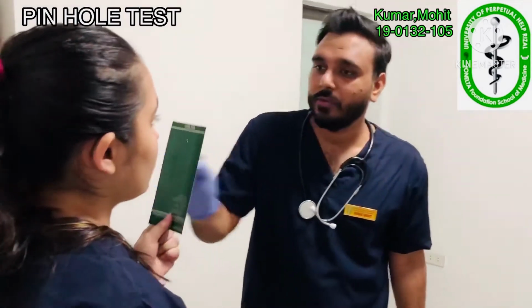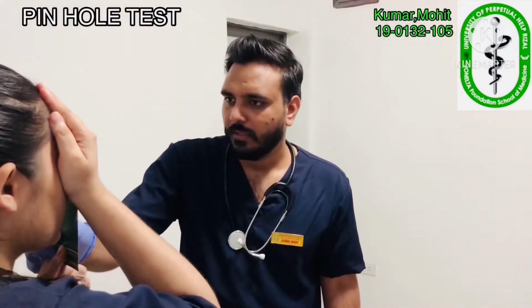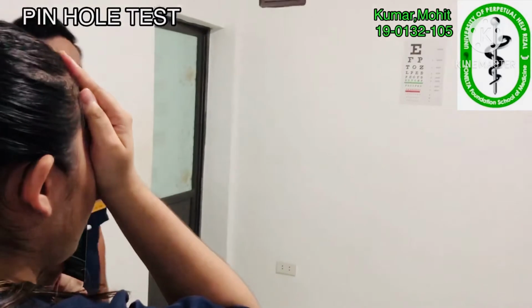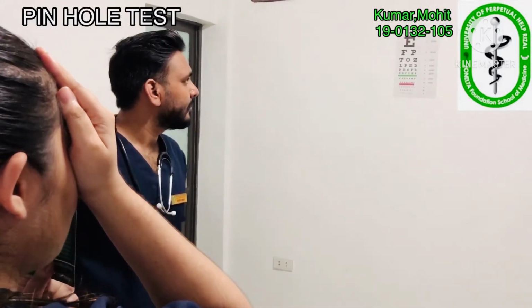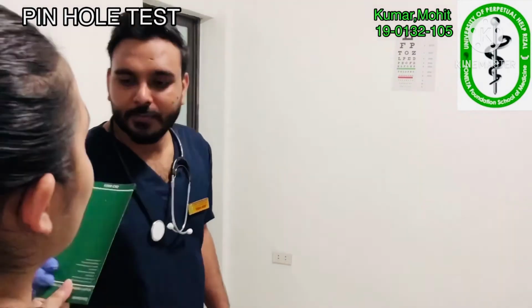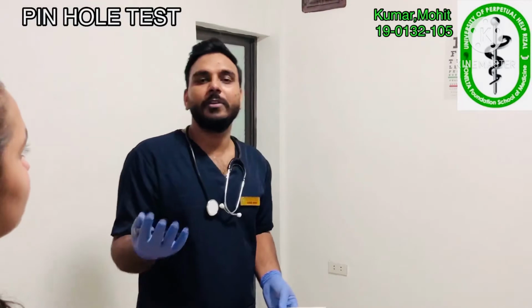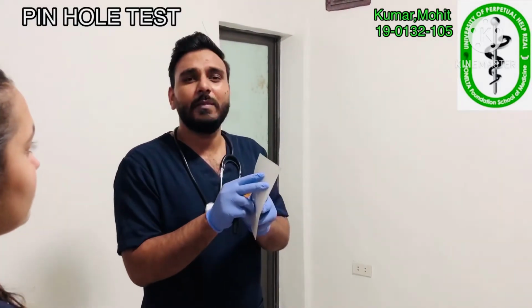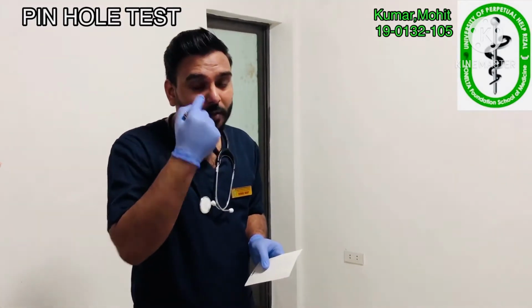First of all, cover one eye with your hand, and now look through this pinhole and read the letters. E F P T P Z D. That's it. That's fantastic, you read it very fast. It means the vision was increased. Why was the vision increased? Because the pinhole is very minute and the light comes directly into the center of our eye.